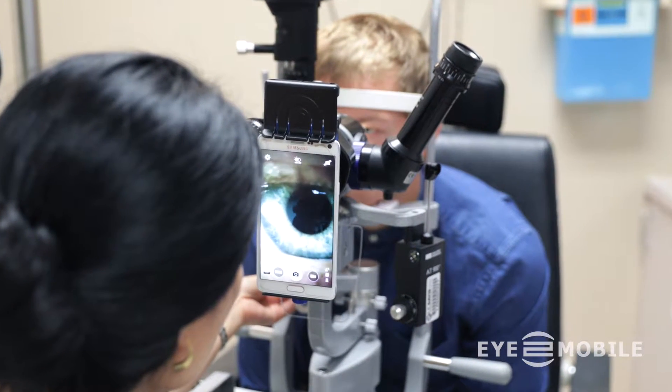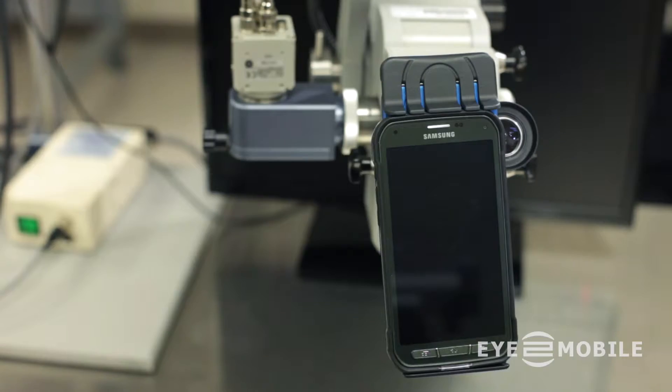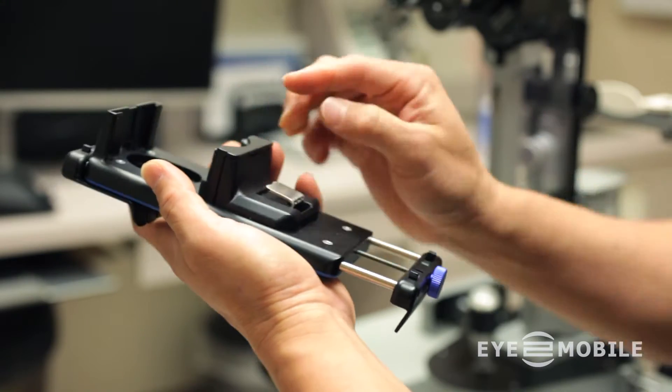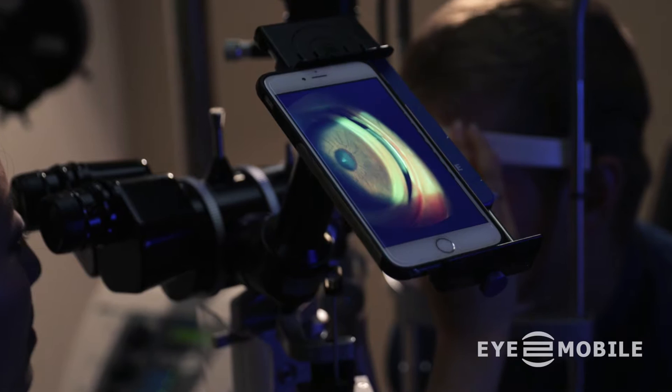Microscopes, especially the slit lamp, come in many different shapes and sizes. Your phone is always changing too. iTWO Mobile's patent-pending design of interchangeable phone clips and optics jaws gives it a unique ability to dock any phone onto any microscope.